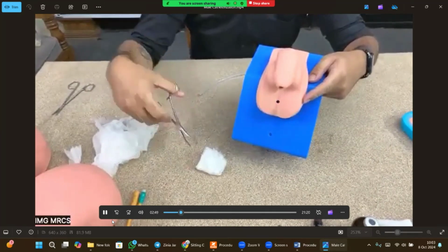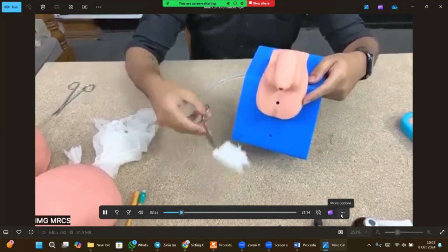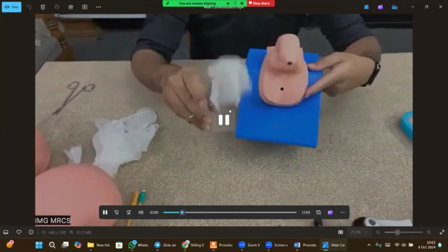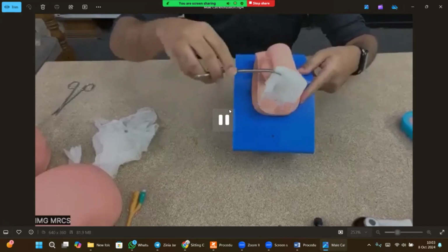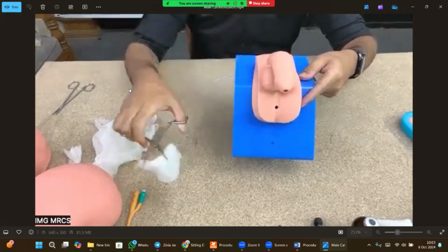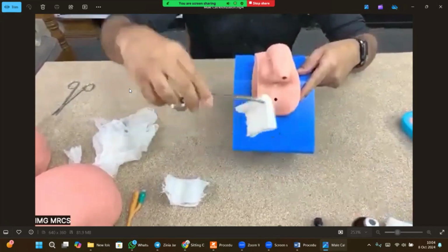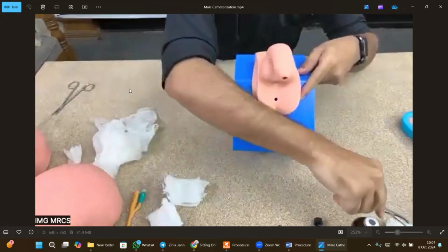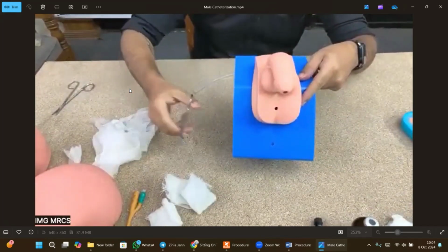How can we give it a wash? Simply, we have to take maybe 3 or 4 gauze pieces, and we are going to start with the glans. And always remember, you cannot reuse a wipe once you have touched the genital area, okay. So you are going to take only one wipe, and then you discard this into the general waste. Take another one. Again, you just simply give it a wash and then you throw it, and you are again giving it a wash. This is done with iodine or normal saline?